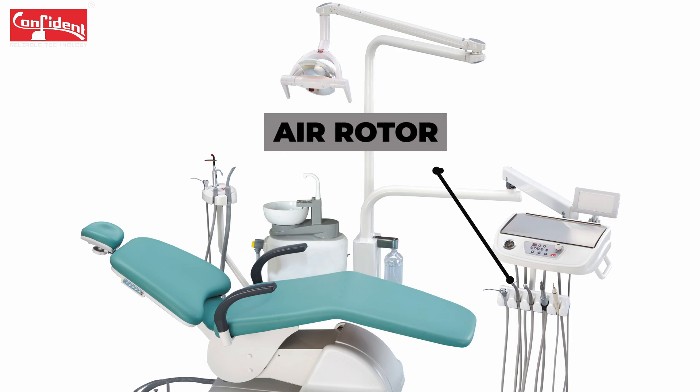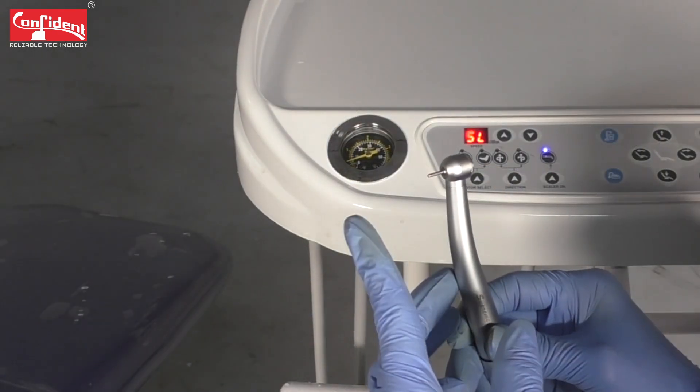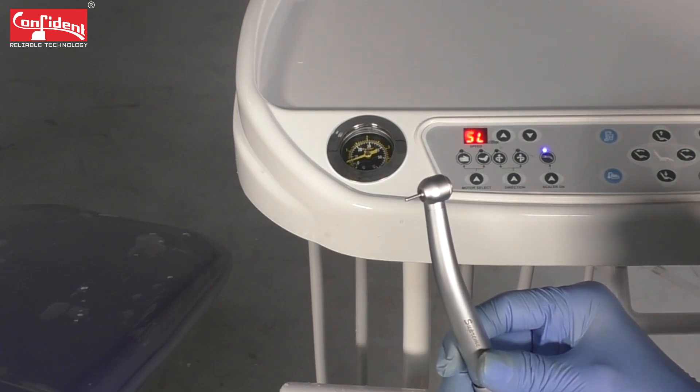In this video you will learn to set a proper RPM to your air rotor. As you can see, I'm not getting a required rotation speed in my handpiece, which means that there is not enough air pressure coming into the air rotor.